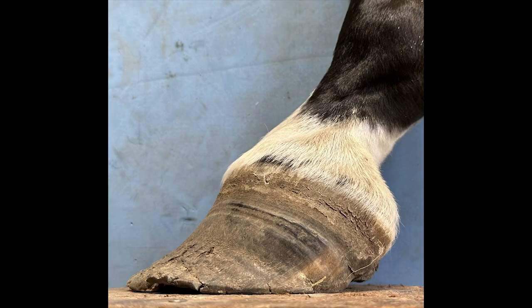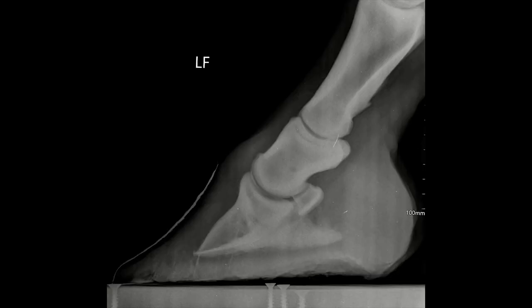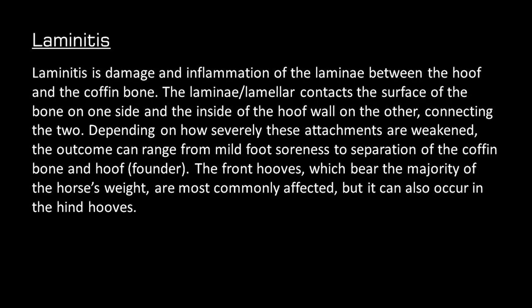So we have completed our initial assessment on the feet. This includes photos, x-rays, and visual assessment. So the vet diagnosis is mild laminitis. Laminitis is damage to the laminae between the hoof wall and the coffin bone.